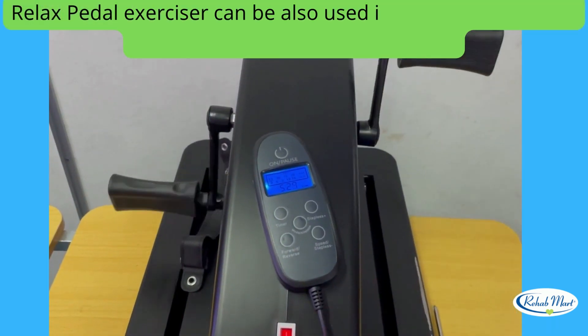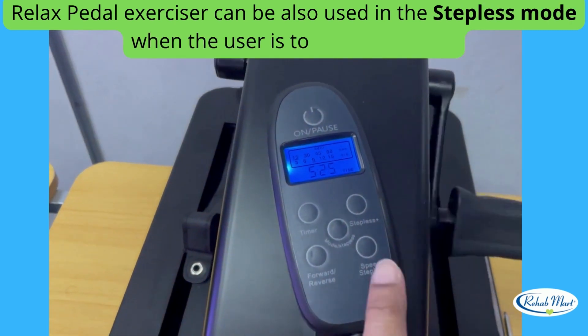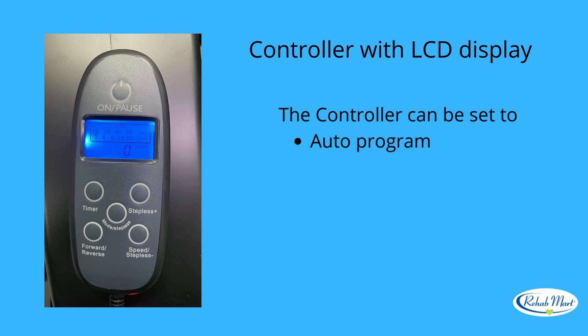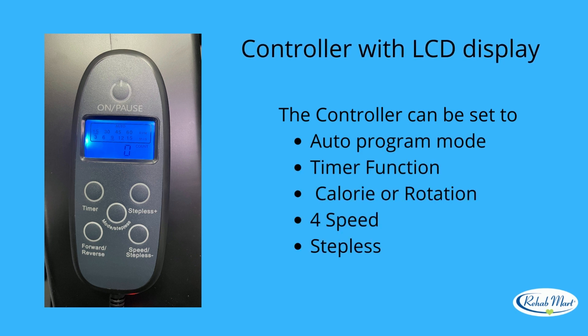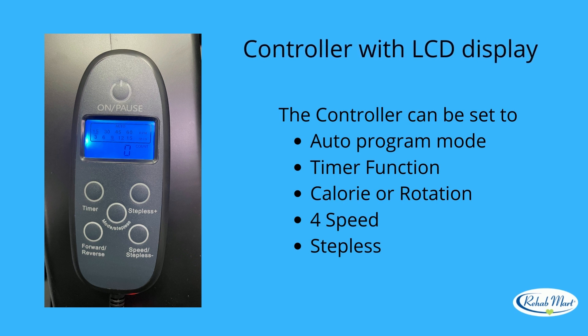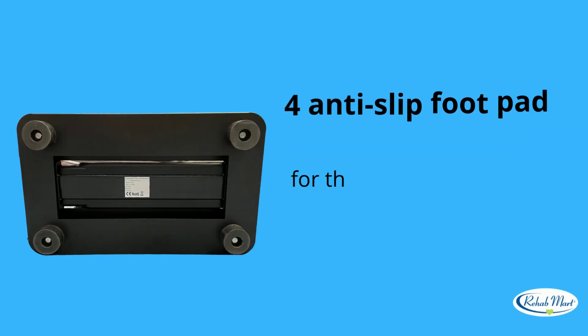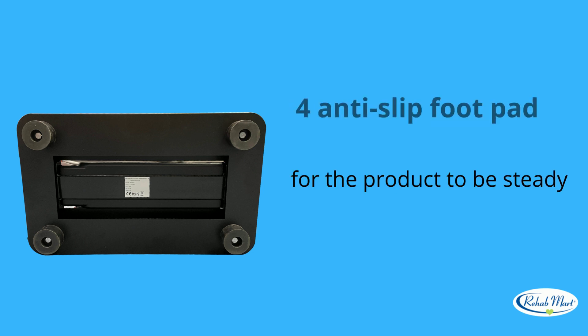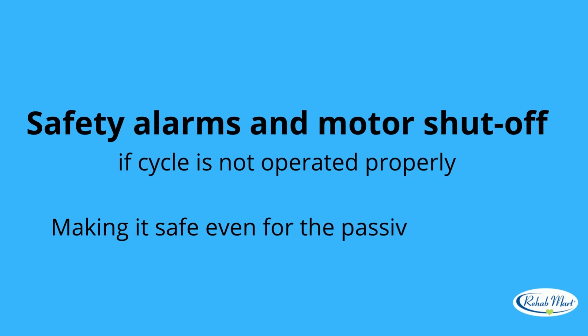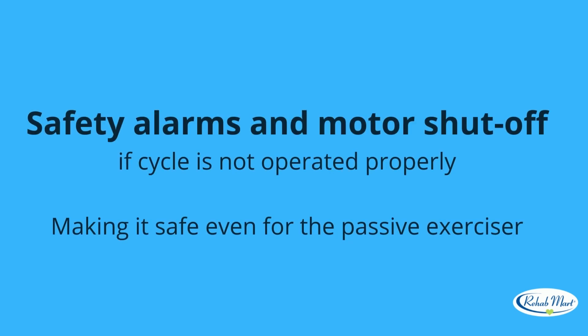Relax Pedal Exerciser can also be used in steppers mode when the user is too weak to pedal. The controller with LCD display can be set to auto-program mode, timer function, calorie or rotation, 4-speed and stepless. 4 anti-slip footpads keep the product steady. Safety alarms and motor shuts off if the cycle is not operated properly, making it safe even for the passive exerciser.